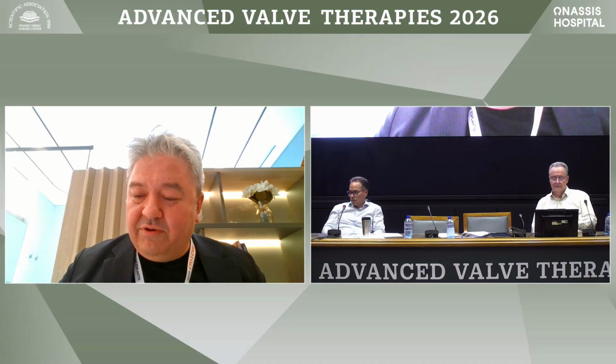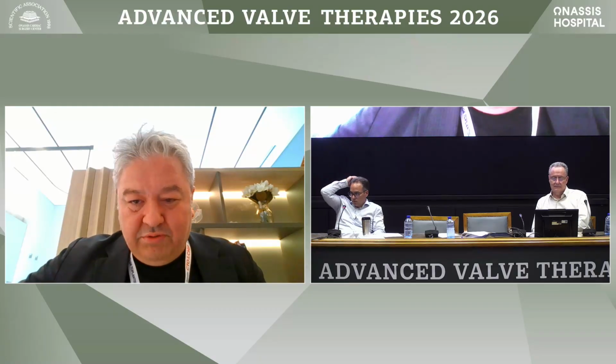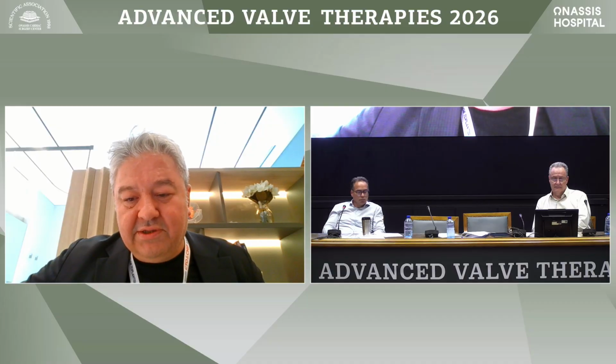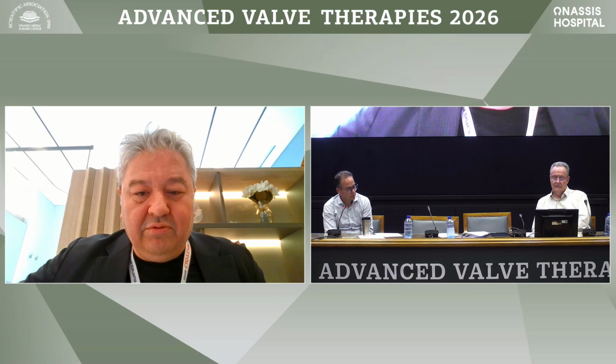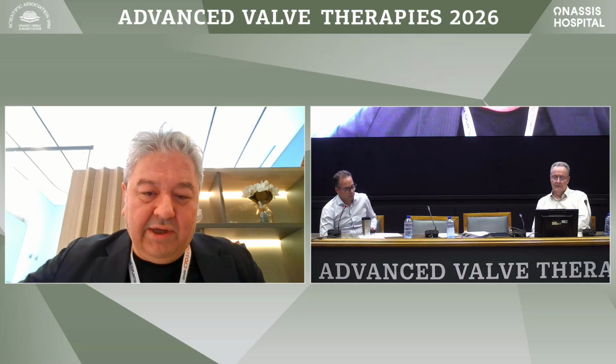So these patients can undergo one or two procedures. And after putting large occlusive devices, there can be some shower effect, some hemolytic problems we observe in the early period, but in one or two weeks it resolves. But if the residual leak is the problem, we have to take the patient to the cath lab again and close the leak, maybe with another device.